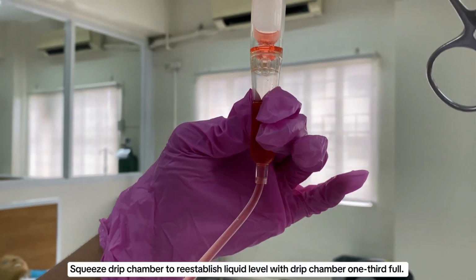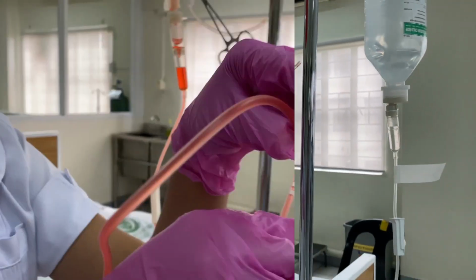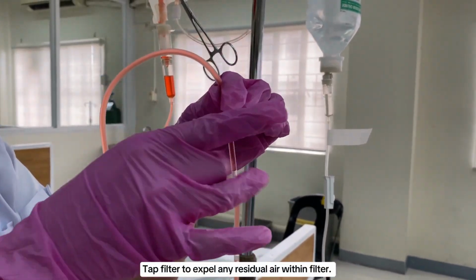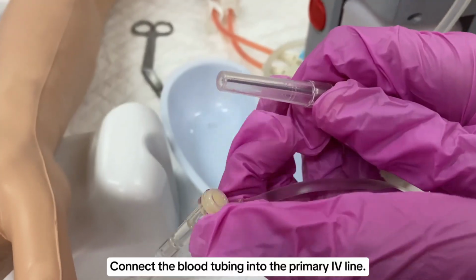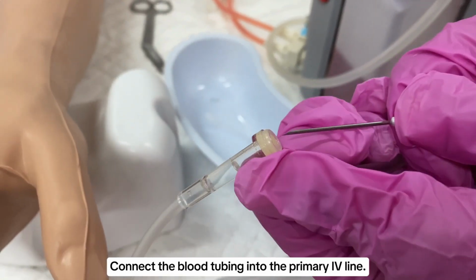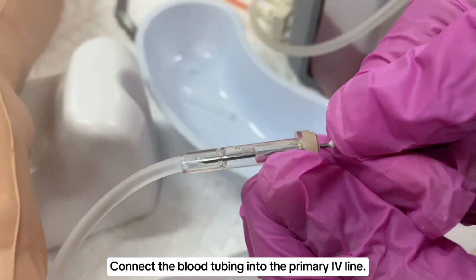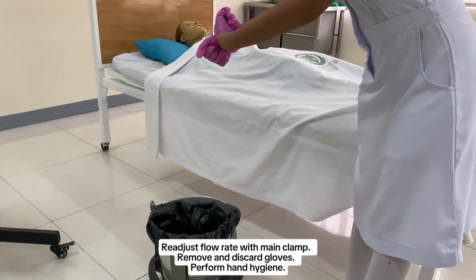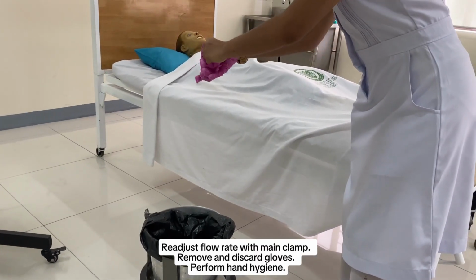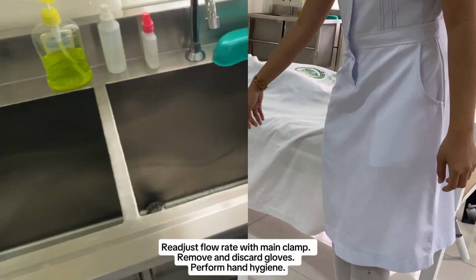Squeeze drip chamber to re-establish liquid level with drip chamber 1/3 full. Tap the filter to expel any residual air. Connect the blood tubing into the primary IV line. Readjust flow rate with main clamp. Remove and discard gloves. Then, perform hand hygiene.